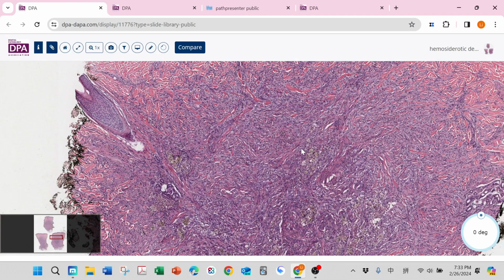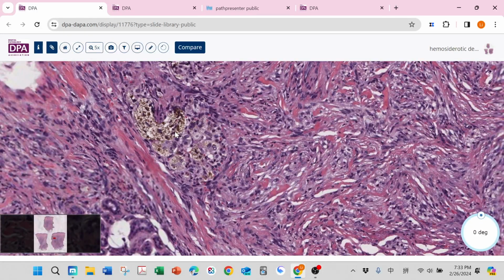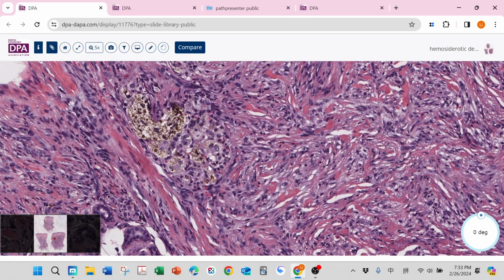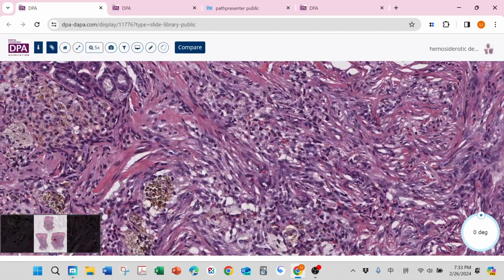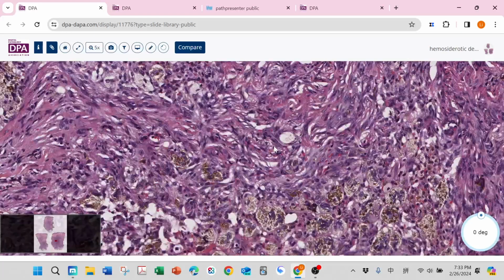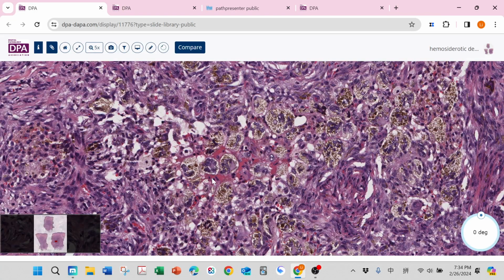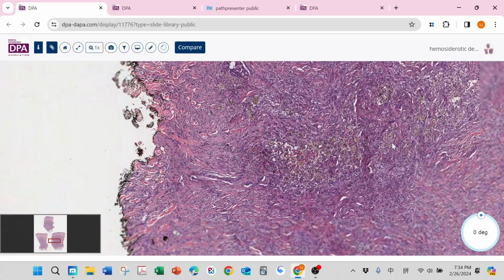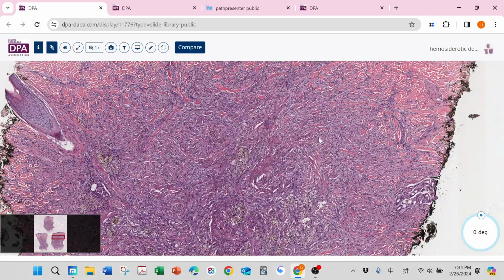If it were a fresher lesion, you would see a lot of extravasated red blood cells. But when you see this hemosiderin around, combined with all the other features, that is a variant of dermatofibroma called hemosiderotic dermatofibroma. Really nice hemosiderin deposition, collagen trapping, that is classic for dermatofibroma.